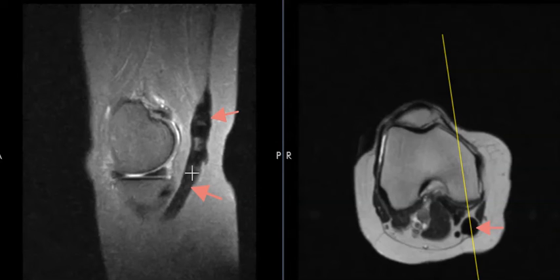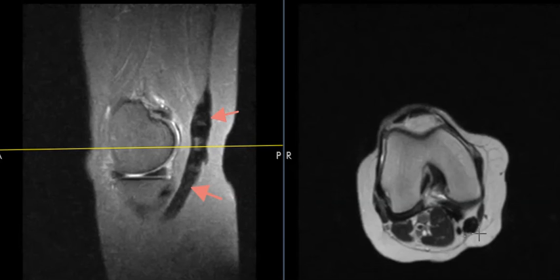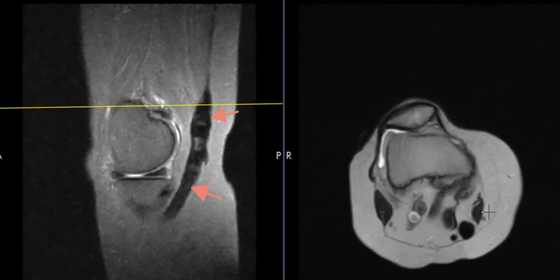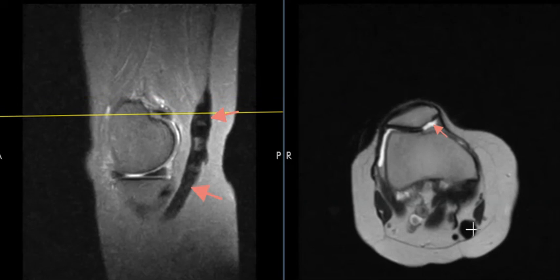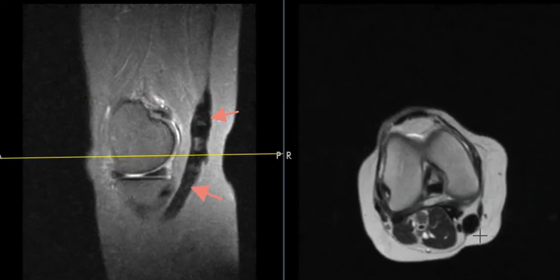And this is markedly thick. I've never seen this before, but it looks like a very peculiar chronic hypertrophic tendinopathy, very thick, irregular gracilis. We see these 1, 2, 3 pes anserine tendons here. This is the sartorius muscle here, gracilis, and this is the semitendinosus there, but a very unusual case.